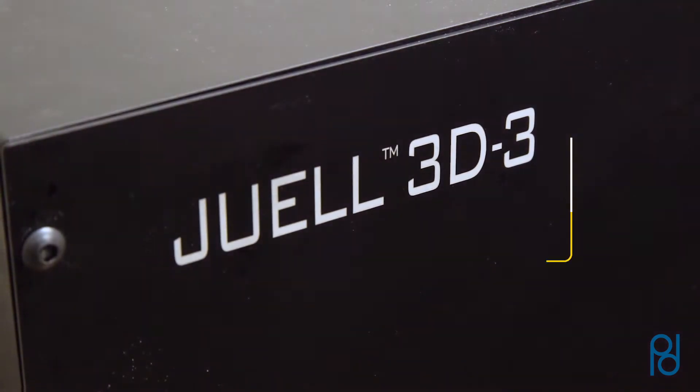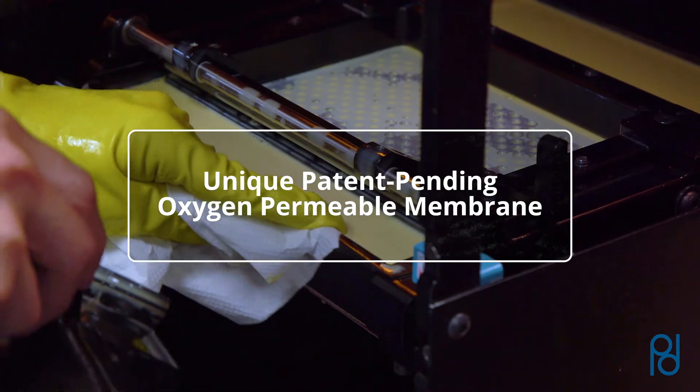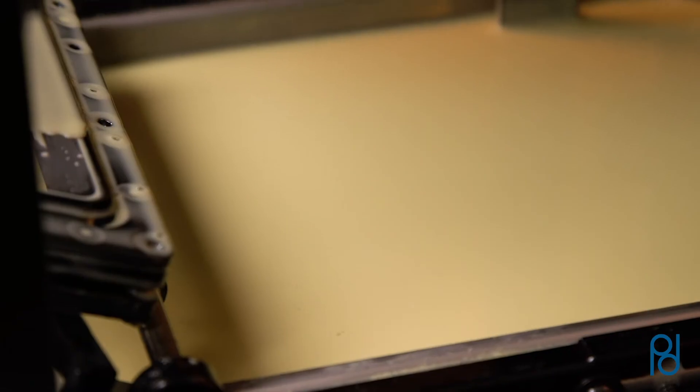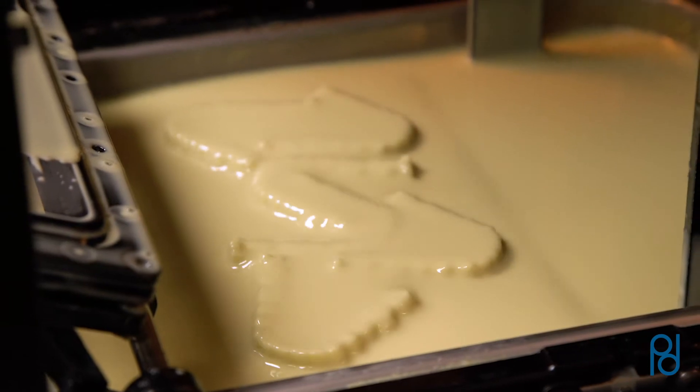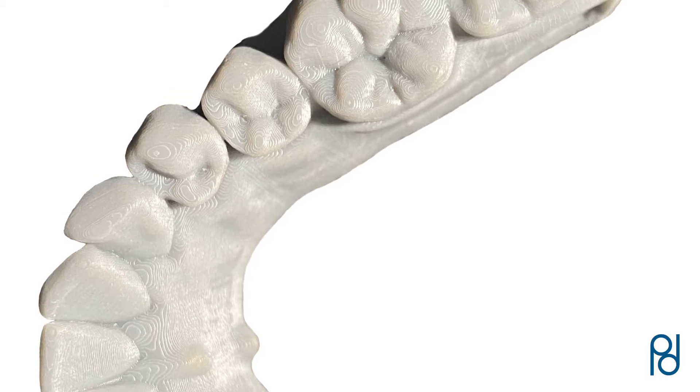JUELL 3D builds 3D models using a unique patent-pending oxygen-permeable membrane, allowing for unbelievable anatomical accuracy. Because of this advanced technology, the JUELL 3D-3 printer boasts the highest level of resolution and accuracy in its class.